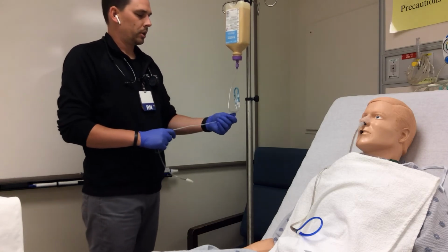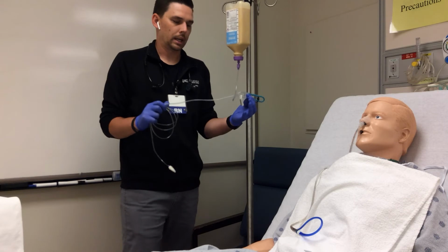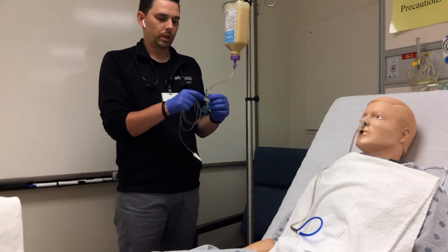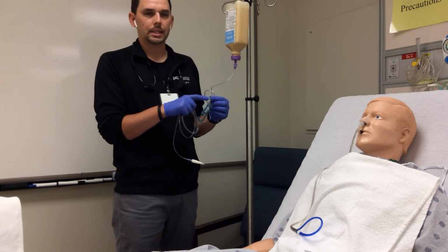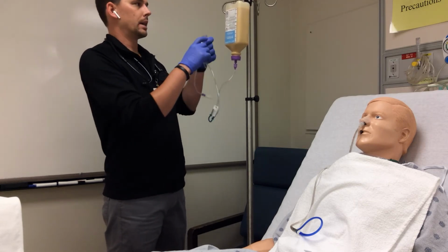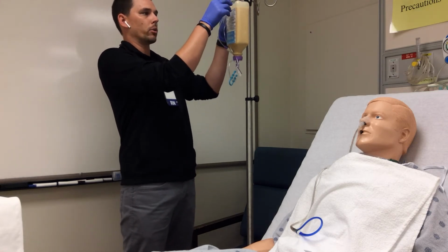From here, we are then going to prime our tubing, and I'll show you how to do that. But we also have a label on our tubing. The tubing we want to label with the date and time that it has spiked the bottle, and our tubing is good for that same 24 to 48 hours.